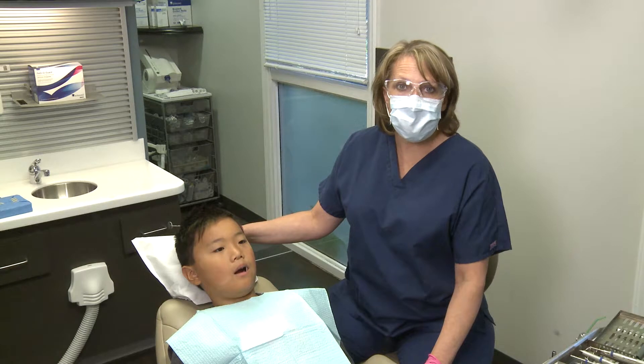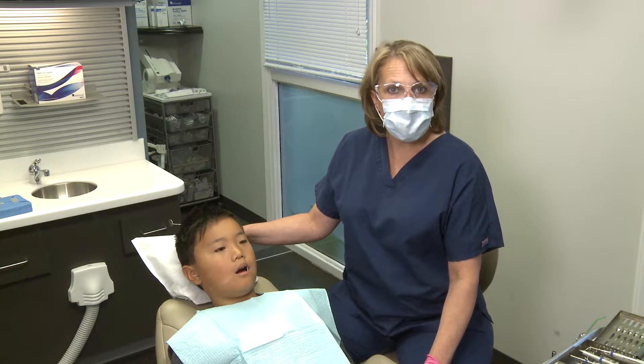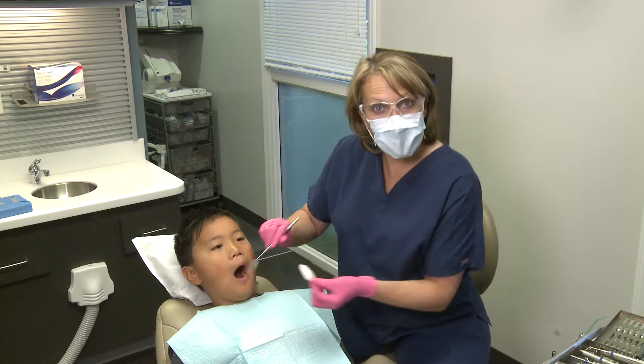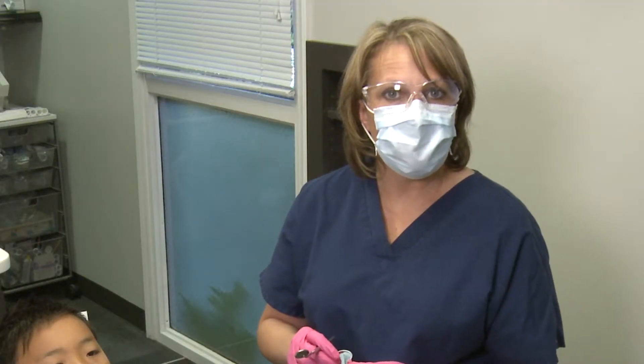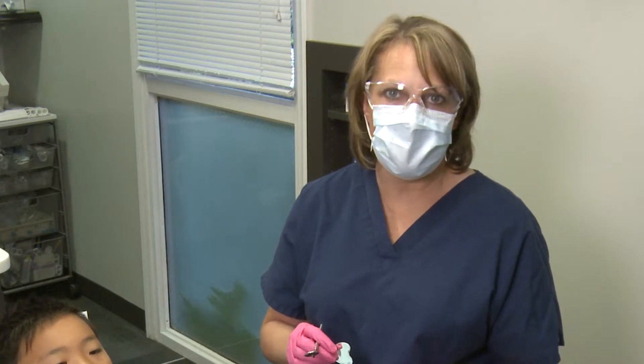The unique characteristics of Richmond Dental & Medical Reflective Shield Plus are that they can be easily removed without re-wetting and they don't stick to the mucosa. Another nice thing about Richmond's product is that it does not pinch the cheek or feel like cardboard to the patient.